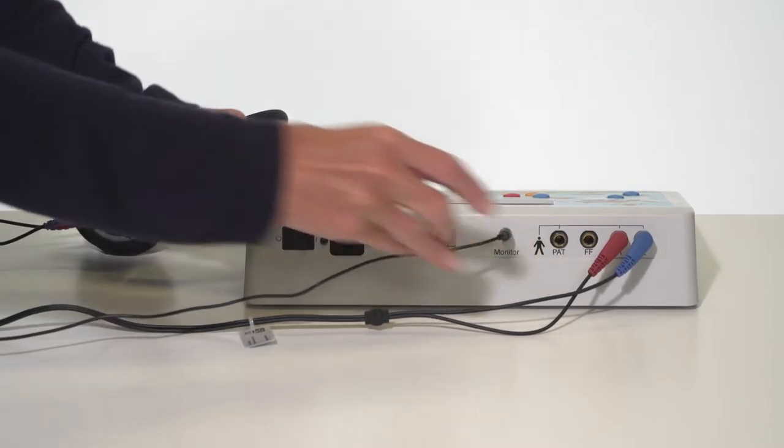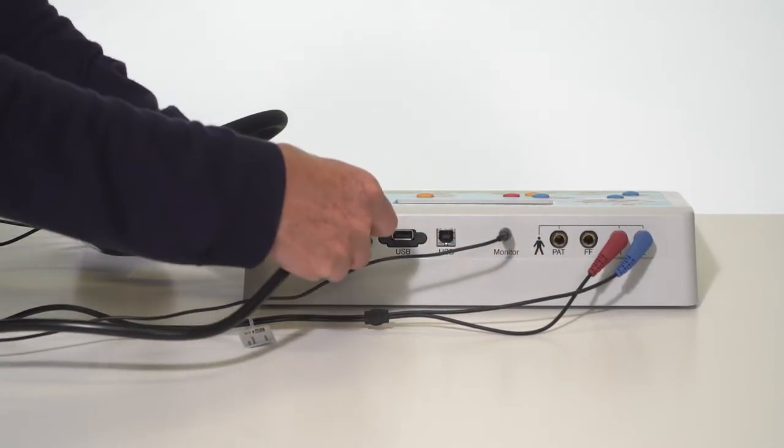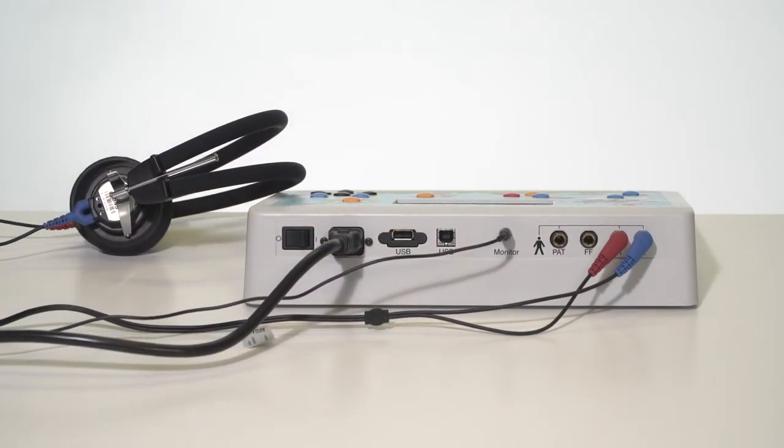Attach the monitor phone for use with the Pilot Test. Connect the power cord to the back of the device and plug into the wall outlet.